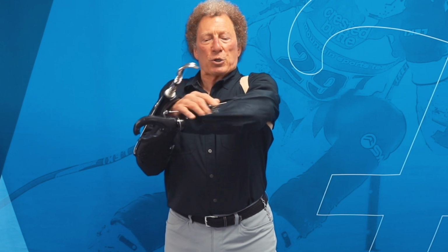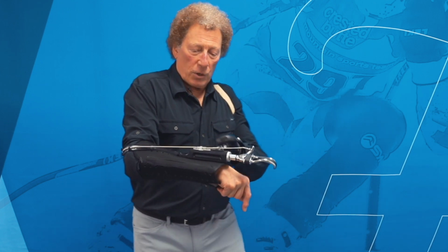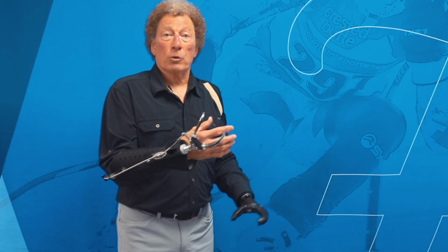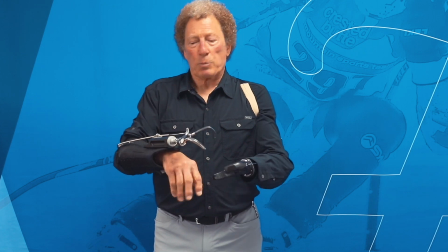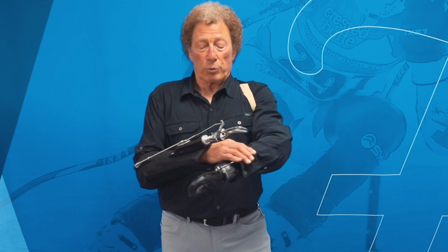We supersede that by putting on objects like a Sherlock system, where you can engage and hold on to things. That's another story. Sherlock, voluntary closing, but Sherlock systems also work with voluntary opening. With a voluntary opening hook, one of the features, as I said, is that it will crush things if you allow it to relax. So with the Sherlock system, I can literally pull this hook open and lock it open. That's a big advantage. I can use it for 2-point hold down purposes, or for 2-point or 3-point support if I'm carrying something. The other thing it allows me to do is to grasp onto a delicate object, adjust to whatever prehension I want, and lock it in place. So a Sherlock should be considered with any kind of body-powered device. It enhances the function and optimum use of a split hook, and it optimizes the function and use of a voluntary closing prehensor as well.